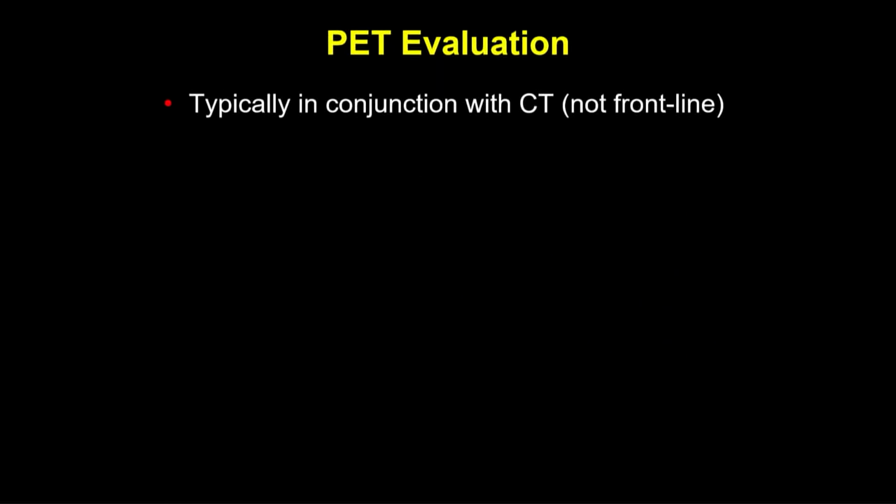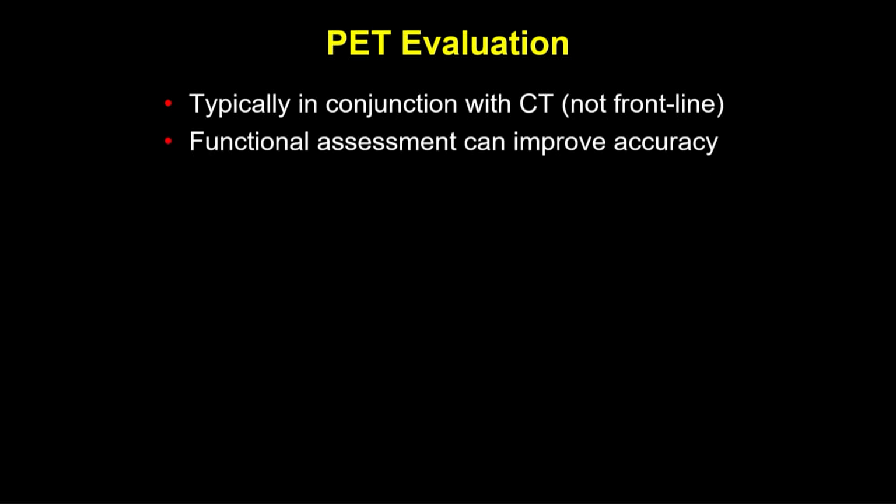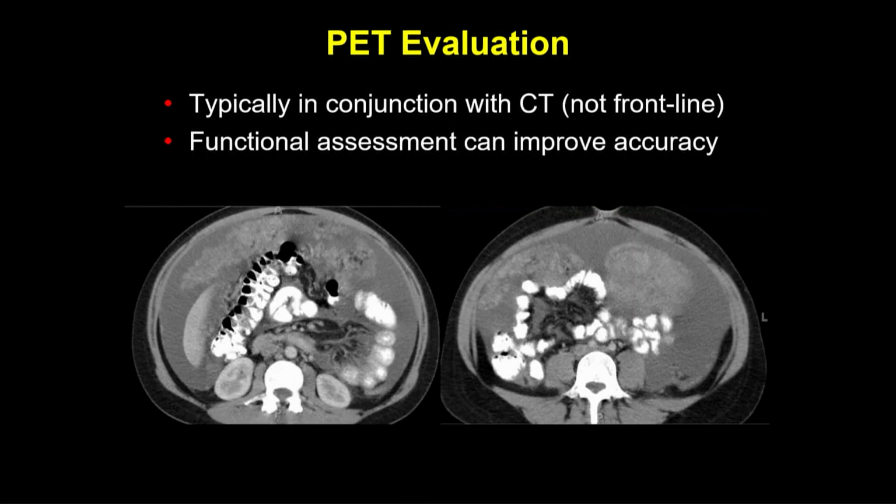And then PET evaluation, we've heard a little bit about PET. I don't read PET, but I do want to at least be able to open up a study and make sure I know what I'm looking at. The functional assessment obviously will improve on our anatomic-only imaging, and so I think we do quite a good job when we look at things like PET-CT or PET-MR.